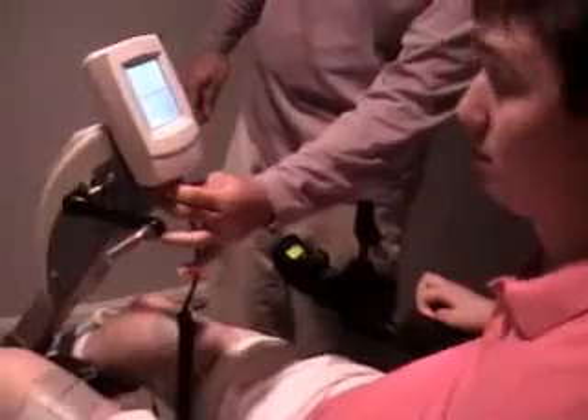What I like most about the bike is that it gives me a cardiovascular workout that I otherwise would not be able to get, because it truly uses your own body's muscles to give you exercise. Not only does it work your lower body, it creates neurological signals below your level of injury that travel up your spinal cord to your brain, signaling that you are moving your legs in a certain pattern. At the same time, your brain is sending signals downward. So it's a great restorative therapy to re-educate your damaged spinal cord.